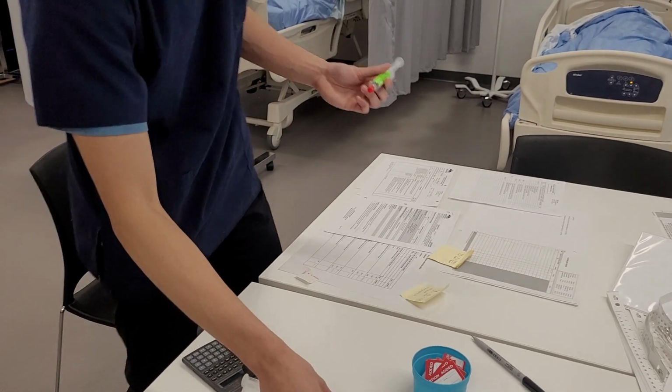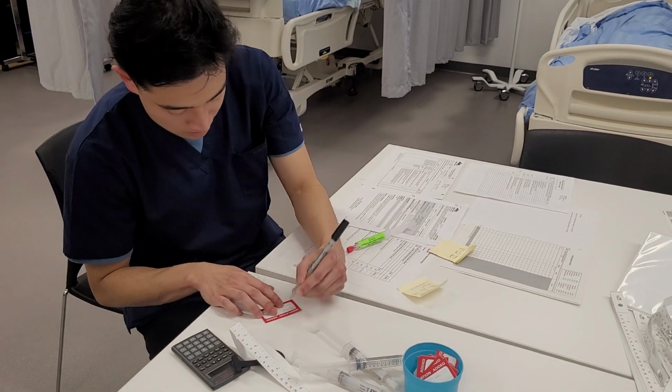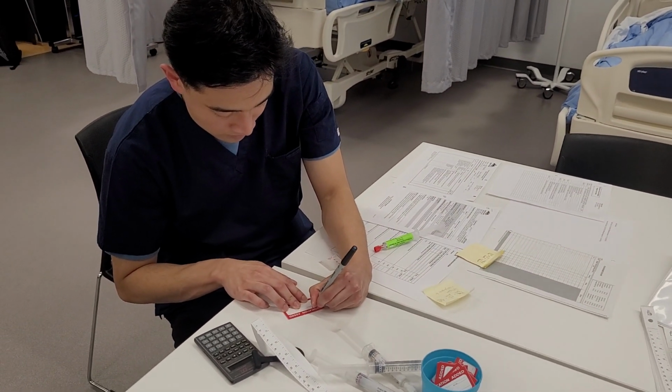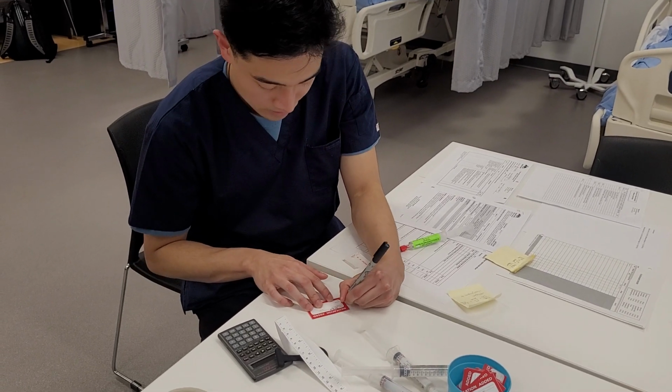So before I do that, I'm actually going to be checking the medication label again, Cefazolin.